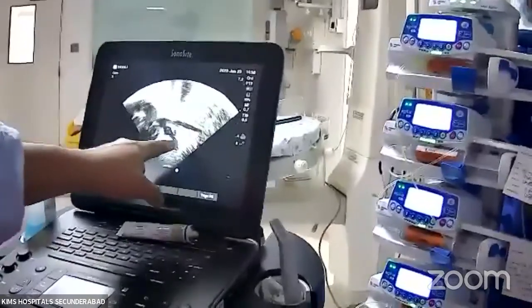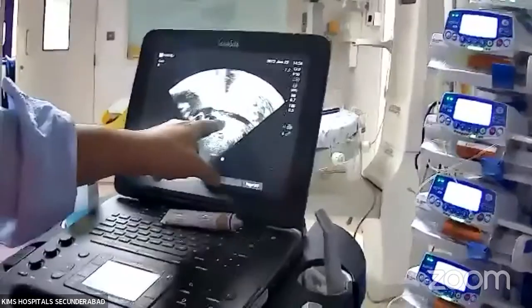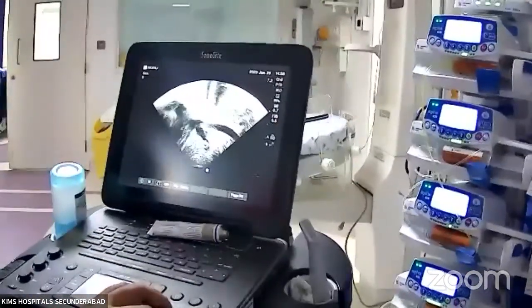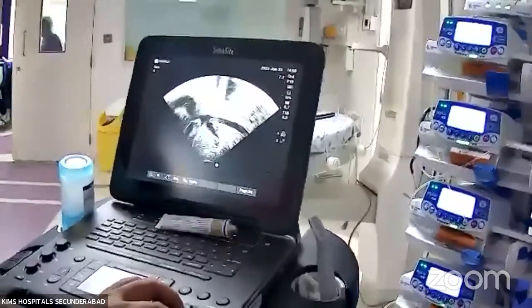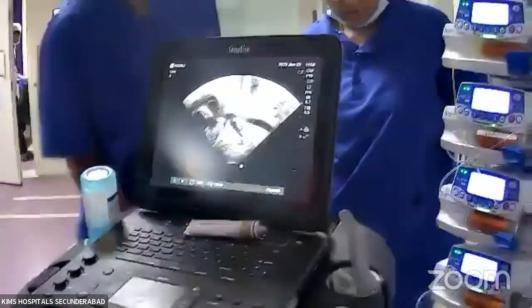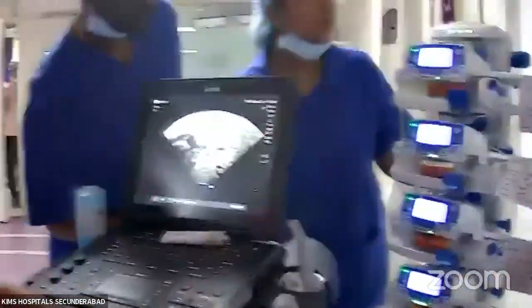See, these are coming, the continuous flow, so you can see there is some flow coming into the IVC. Just flush 2 cc. Purge. The UVC, the inotropes are going on. Okay, but just purge 0.1 cc.